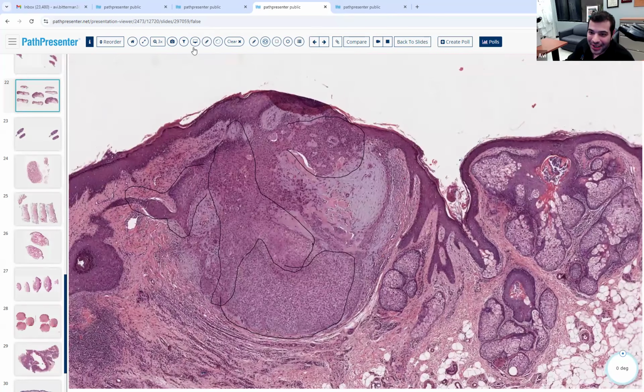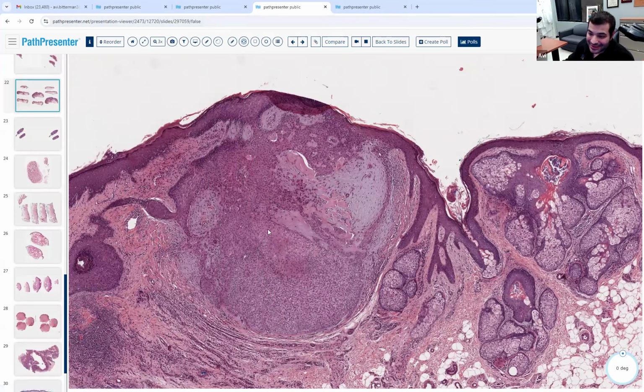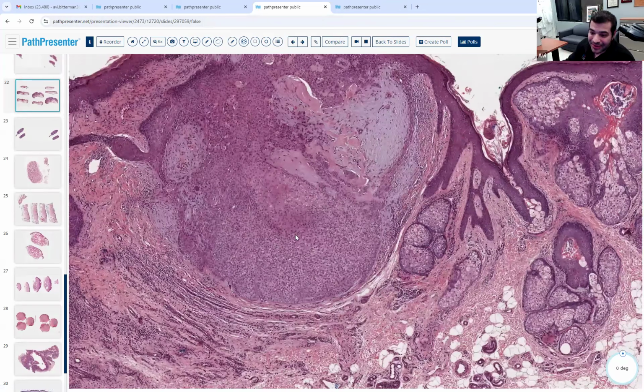So if I were to draw a line between this, it's not perfectly symmetrical, but actually overall it's not that asymmetric. We got an arm here, we got an arm there, we got a leg here, a leg there, we got this span over here. So it's not crazy asymmetric.